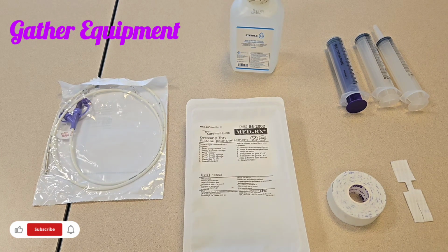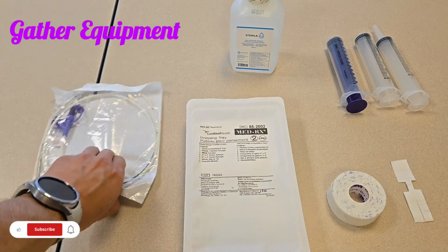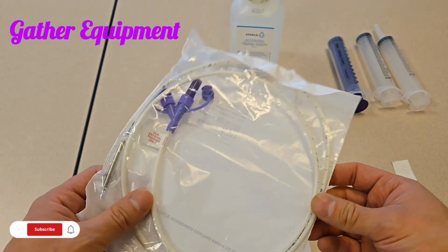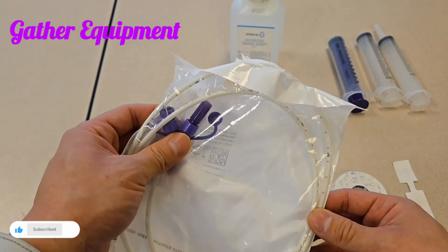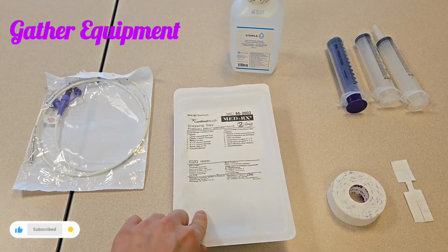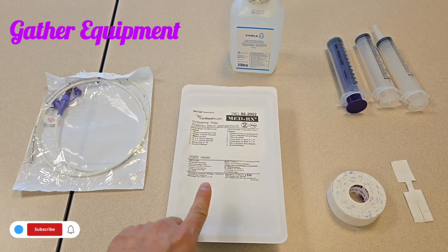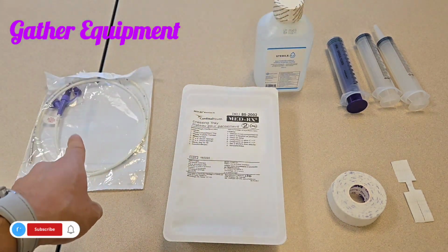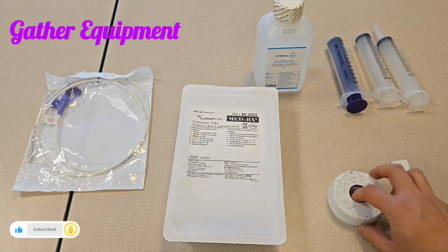So to insert a tube for feeding, which at our institution we make a very clear distinction, we are going to be using the Enfits, which are the beige colored tubes that have the purple connector, and this part here is the metal guide wire. We're going to have a dressing tray so that we can set up our field. We're going to have some sterile water to irrigate this and flush it because it's necessary. We're going to have a tape.